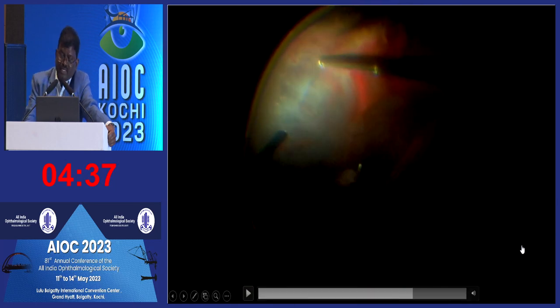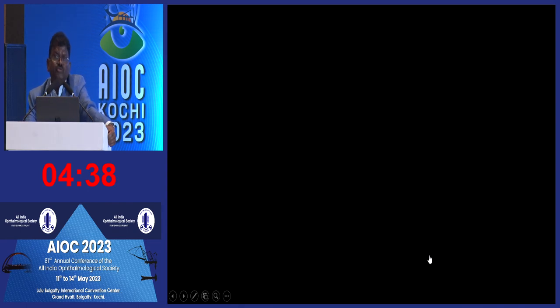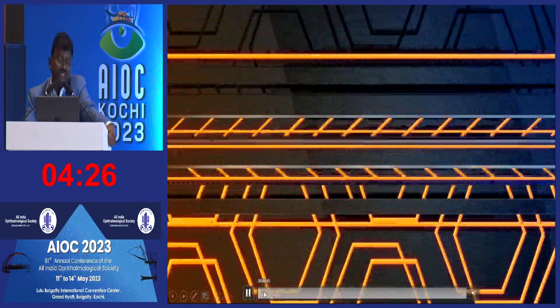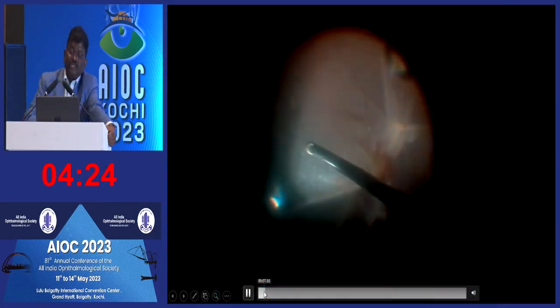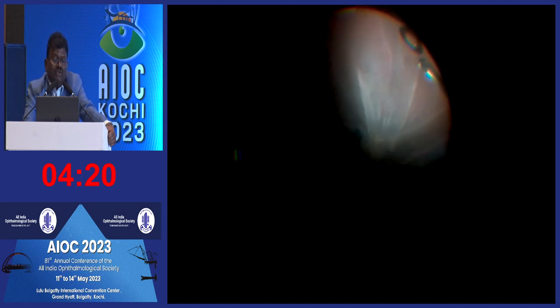The other technique is because it's a blind procedure. Many people think that you will be having bleeding, you will be entering into the retina. So in that case, you can still go for visualization. So this is another case of gliotic tissue. Very minimal vitrectomy is done so that you can have a good scaffold. The retina will not settle.